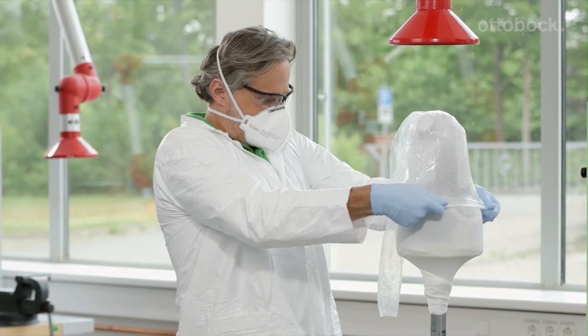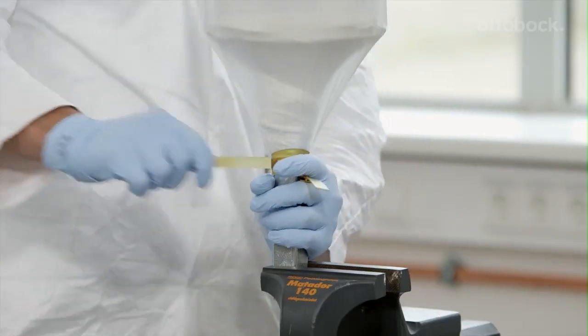Now, I pull a soaked PVA bag over the plaster model and apply an initial vacuum.